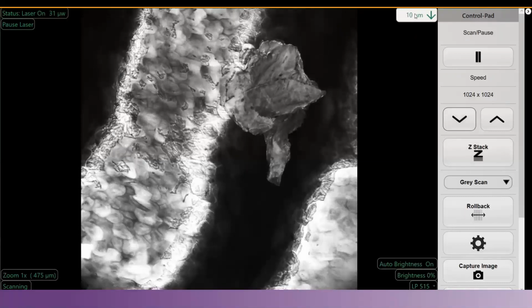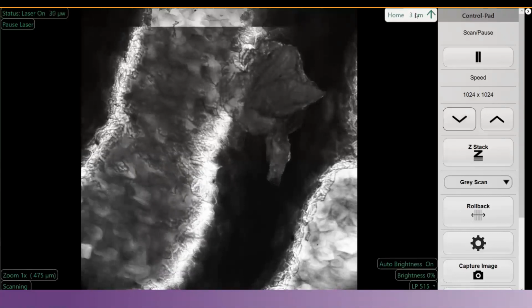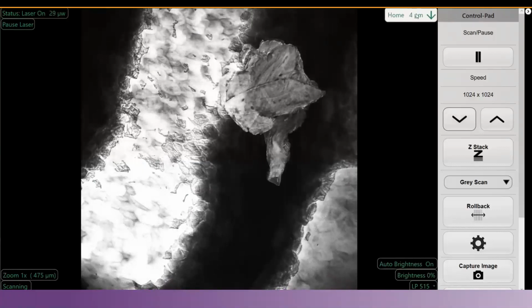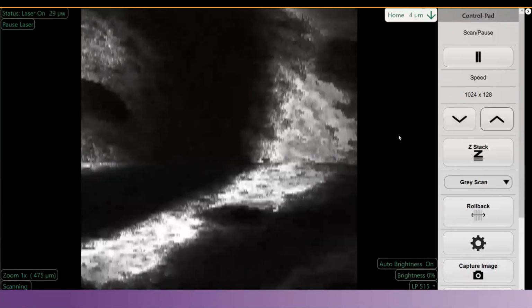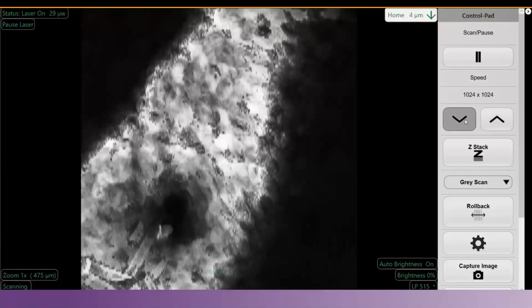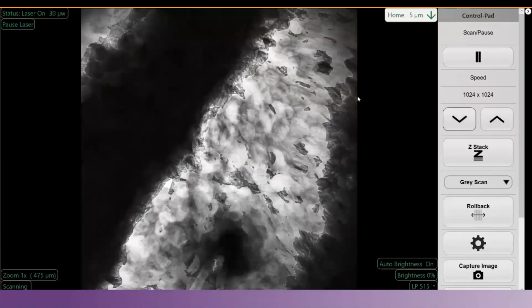So it's super simple, and yet you can get all the details that you would be getting from the benchtop microscope. Now, if I want to go for benchtop microscopy, it would be a really complicated protocol. So you can see all these structures and how the layers of the skin are organized. Okay, this structure also looks interesting. It's probably an opening of the sebaceous gland or sweat gland. And you can also see some debris that is associated with that. So maybe I should go and take a bath.